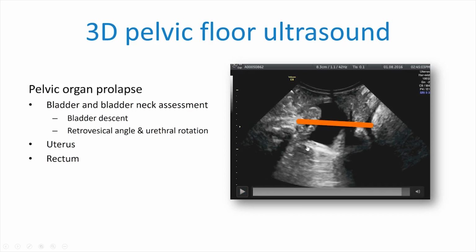can see that her bladder started well above the pelvic floor, and now it has descended down past and through the pelvic floor, so it's right through the hiatus, so that it's actually a couple of centimetres below the base of the pelvic floor. So this is a significant bladder prolapse, so you can see very clearly.